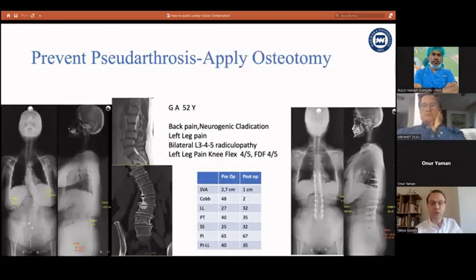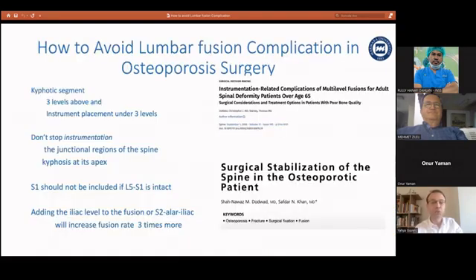It is important. Again, in these patients with adult degenerative scoliosis, we made osteotomies in here because there is a very rigid area here. If we make osteotomies at the correct levels, if we select upper levels for fusion and correct inferior levels, again, we reduce stress on this instrumentation. So we prevent pseudoarthrosis, and we prevent instrument breakage.